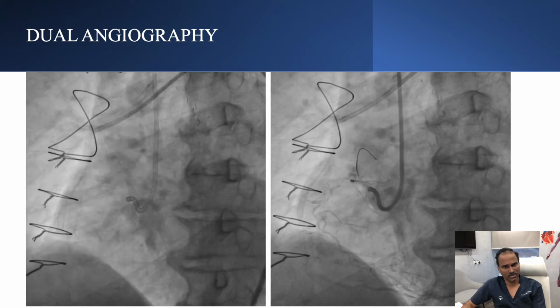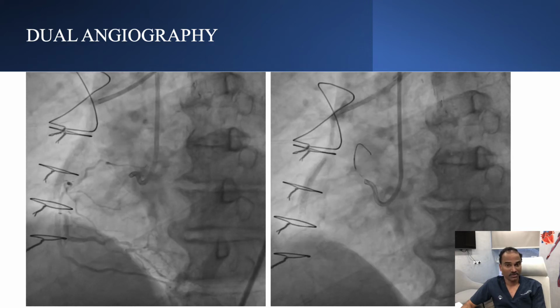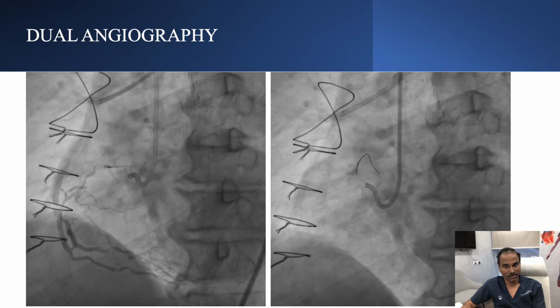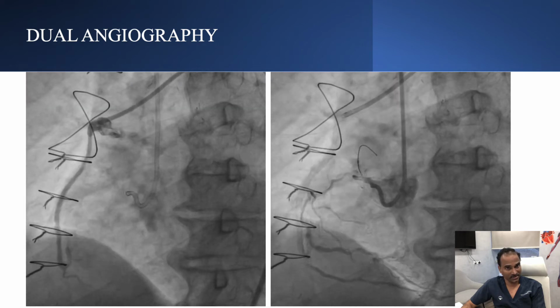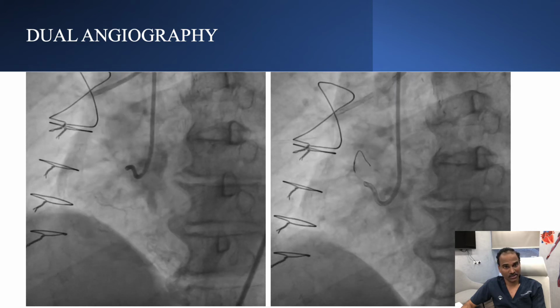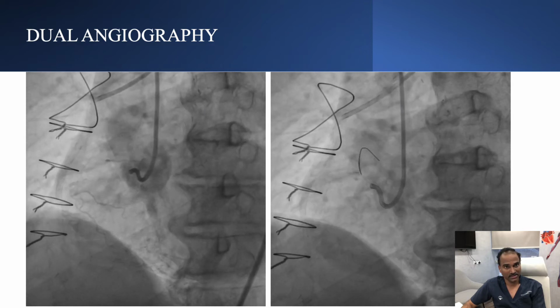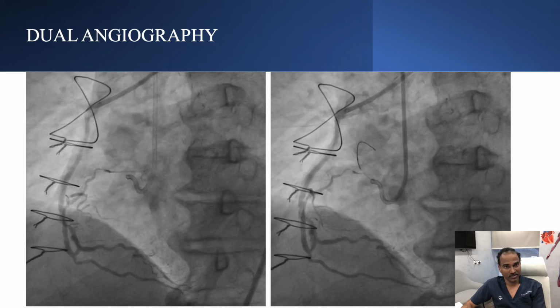You can see it's a very short segment, and you can also see a pseudoaneurysm here, which was not there before. This aneurysm was formed due to repeated antegrade attempts which were done in previous sittings, and as this space was connected to aorta, it got expanded and formed a pseudoaneurysm. And this is a site of stent in stent where it got occluded again, and POBA was done just to tide over the crisis.